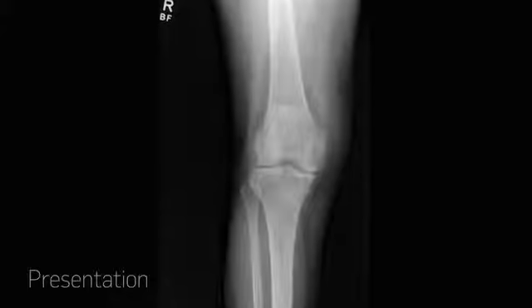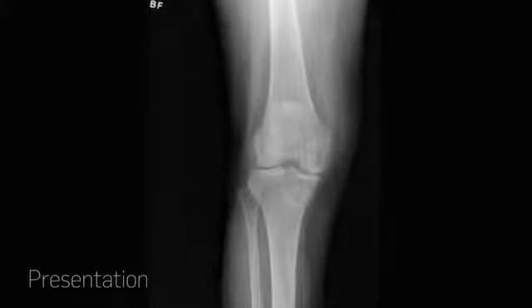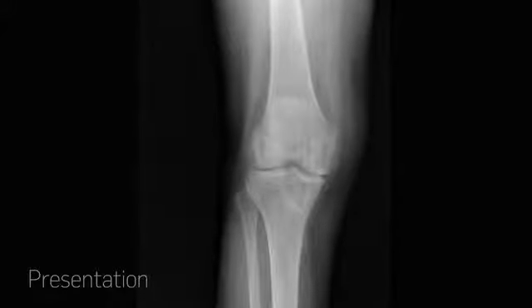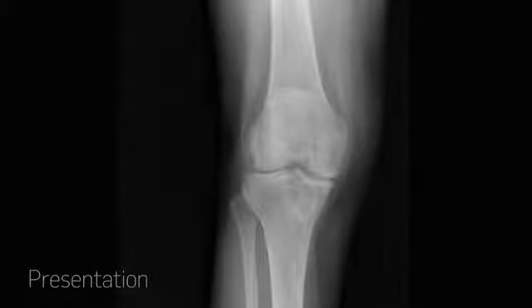The first image I have there is the X-ray image on presentation. It's an AP of the knee, and some of the things that were concerning to me based on this imaging were, first thing you notice is the striking, what appears to be possibly bone loss and very likely osteomyelitis on the tibial side, and there's some findings that are consistent with osteomyelitis in the tibia based on just that X-ray alone. The femoral side of that didn't appear too concerning, but that's what prompted us to perform MRI.